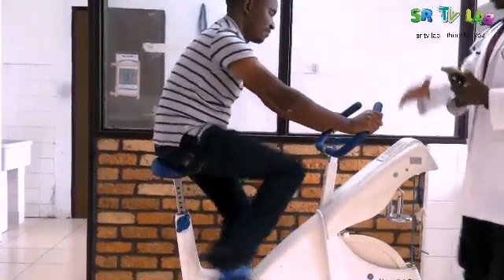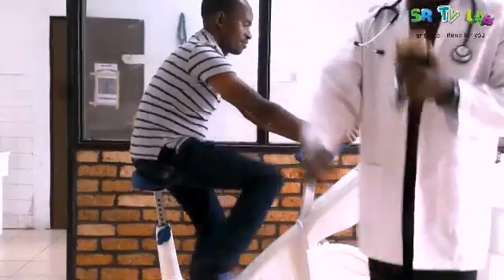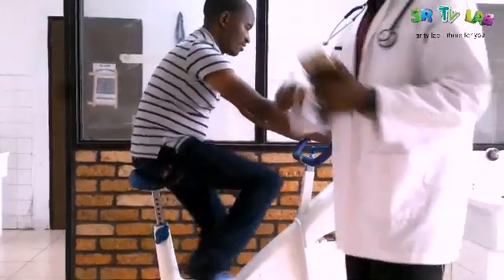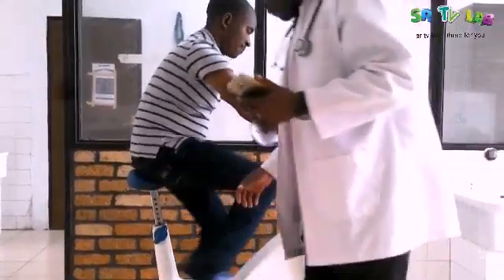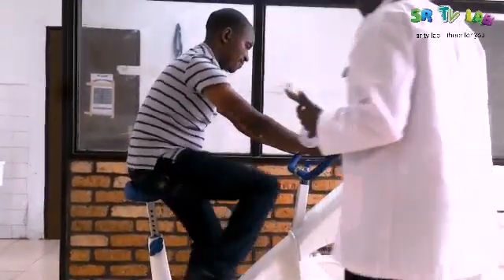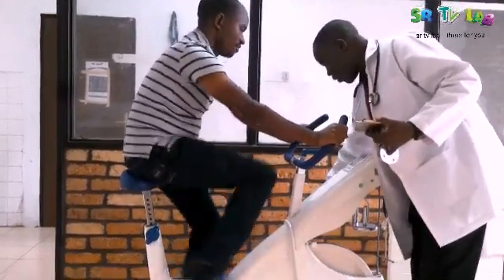Keep the wheel going. Our patient should keep the pace — just 60 steps a minute, meaning one circle per second. Let me add one more weight.